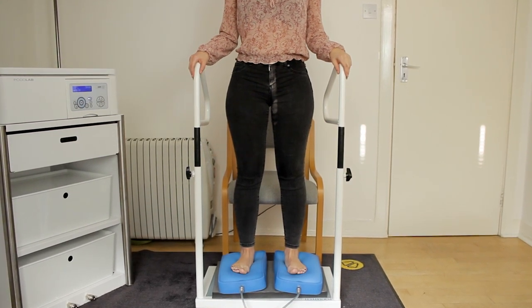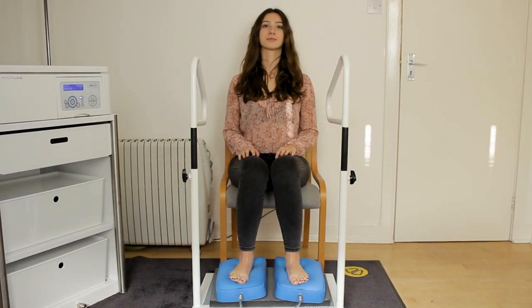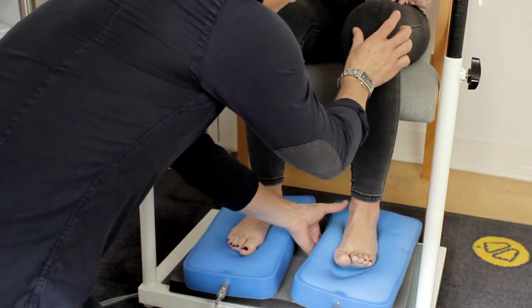Both feet are molded individually using your weight. Optimum alignment is then achieved when you're sitting down and non-weight bearing.